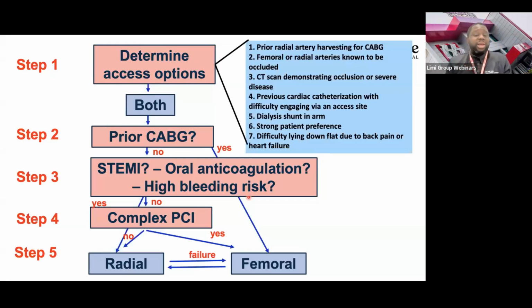Some people have a lot of difficulty lying flat. When we use femoral, the patient typically has to lie flat for 6 hours after the procedure. And so you must make sure that the patient is able to do all of these things.